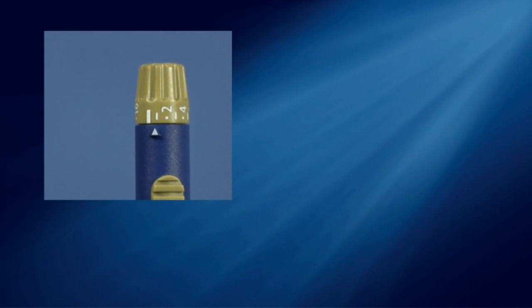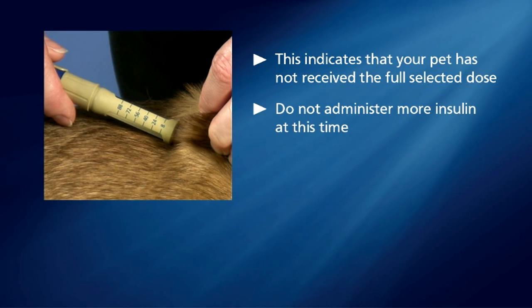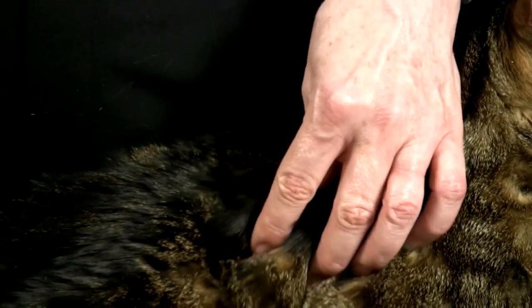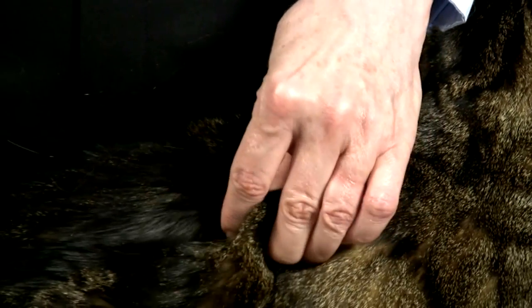If the dose selector stops before the start line returns to the arrow, this indicates that your pet has not received the full selected dose. If only a partial dose was administered or your pet dislodges the needle before you count to 5, do not administer more insulin at this time. Wait and give your pet the usual dose at the next scheduled dose. If you are injecting your cat, you follow the same instructions using the injection technique recommended by your veterinary professional.